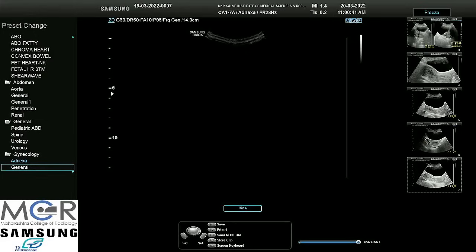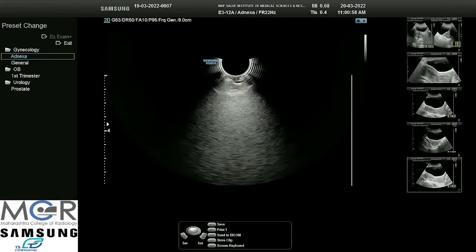We have now given position to the patient. I would like to use this volume probe. We have put jelly inside the probe so that there is no air column, and we will apply some jelly from the top also. When doing ovulation study, we avoid putting jelly because it might hamper the sperms — they may get killed. But this is a simple gynec case. I have placed my thumb and put it in.